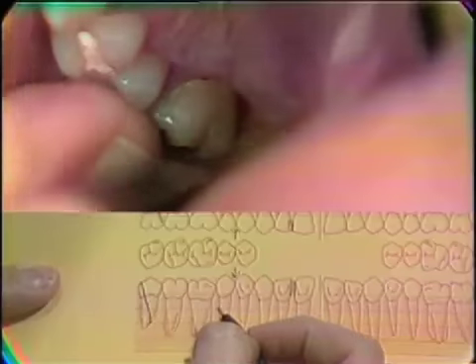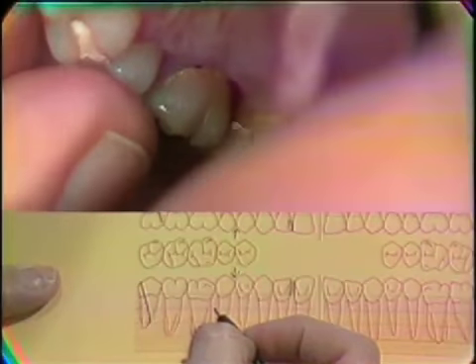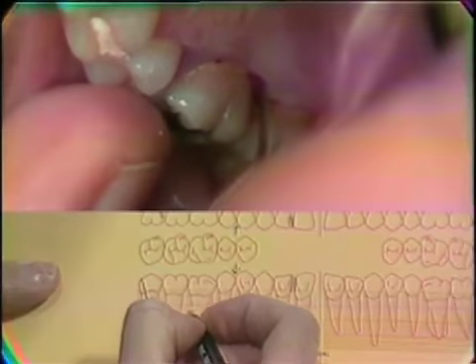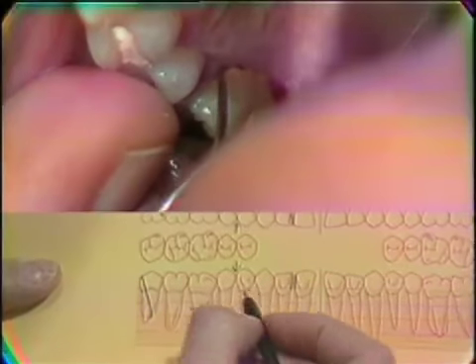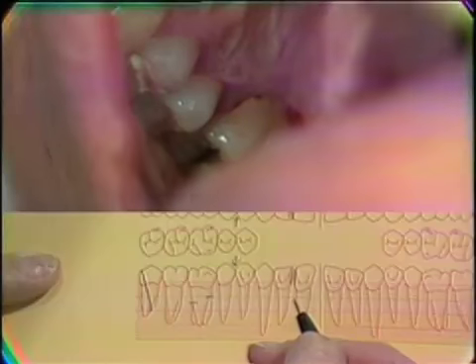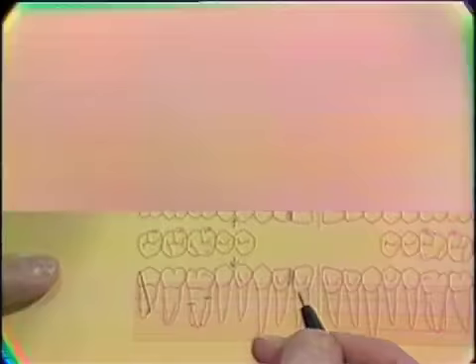There is a beginning furcation involvement on the distal lingual of tooth number 3, and on the mesial lingual of tooth number 3. No other furcation involvements are present. Periapical area? There are no periapical areas.